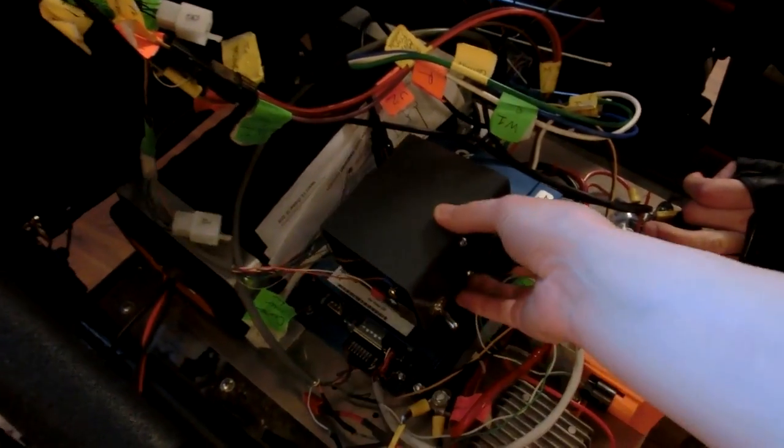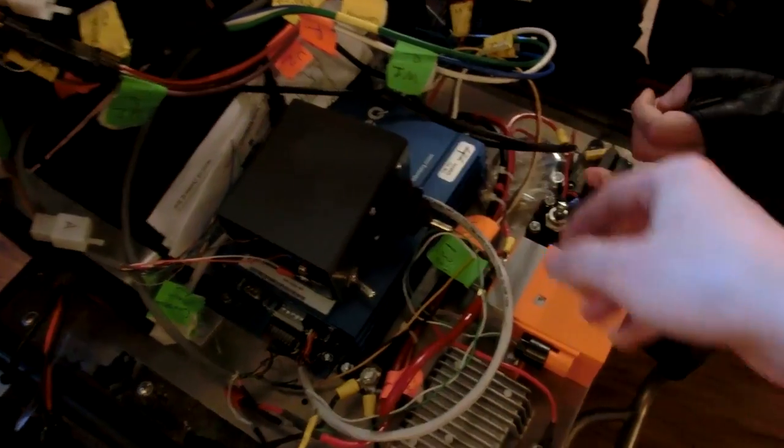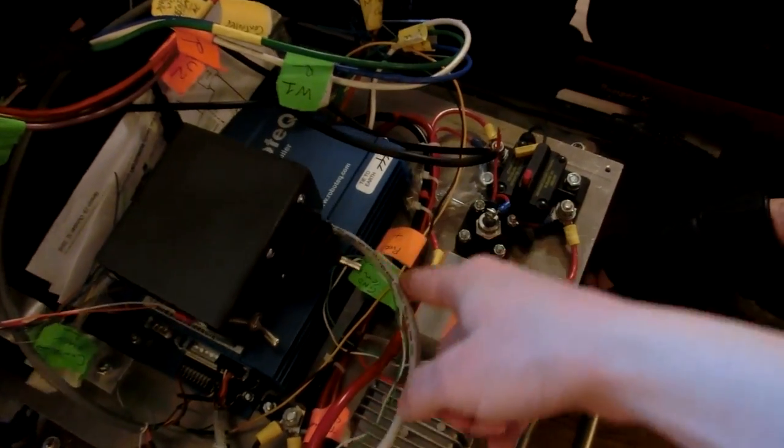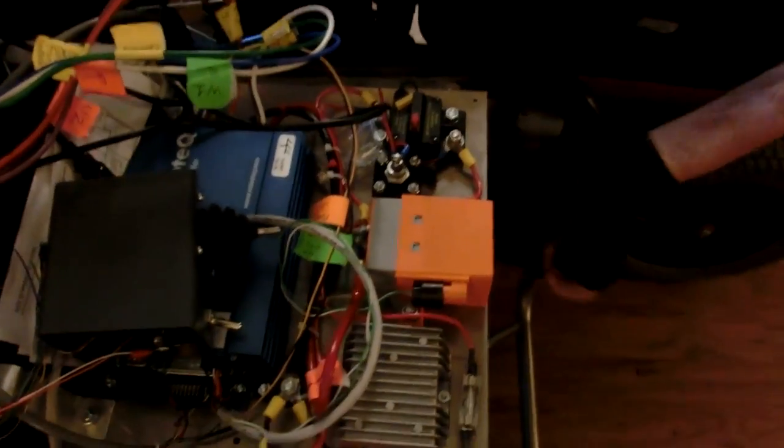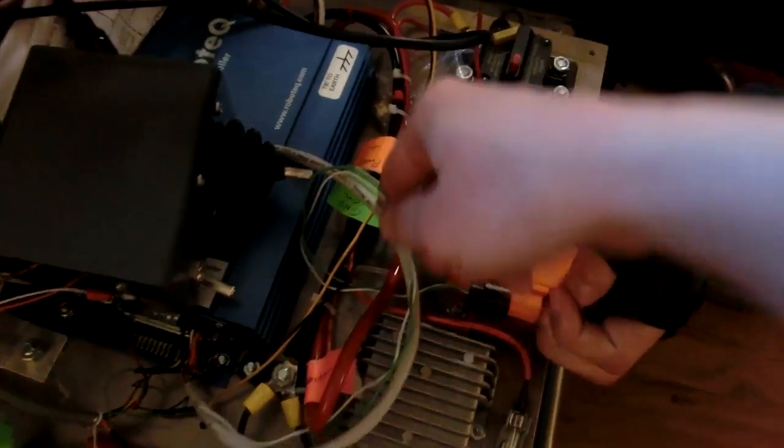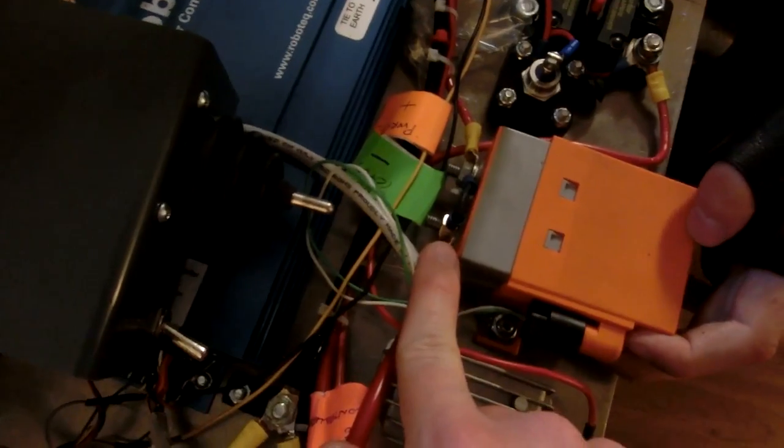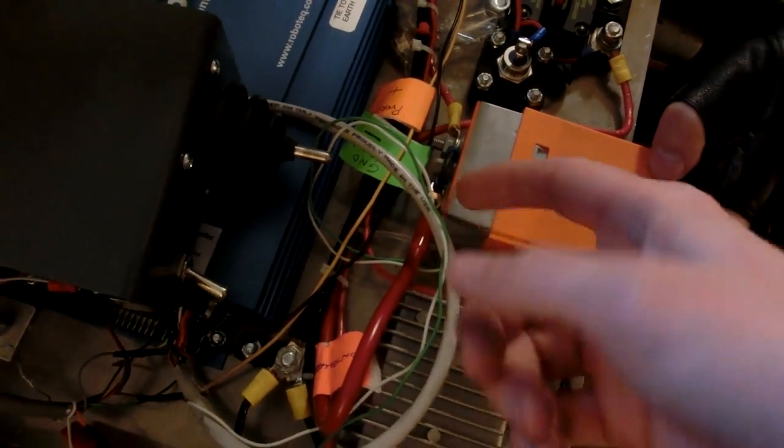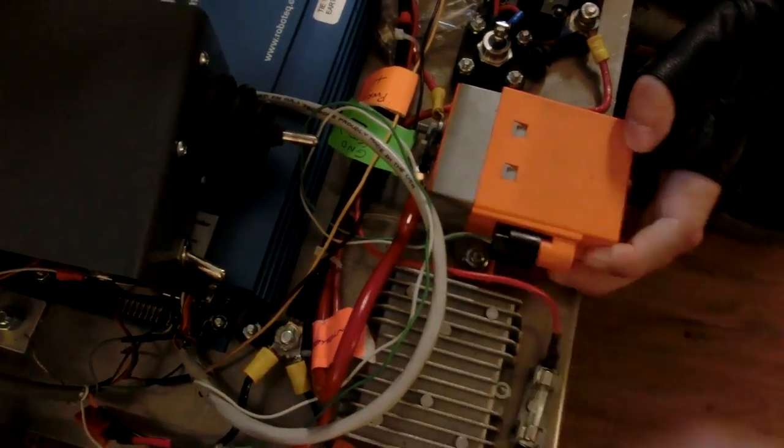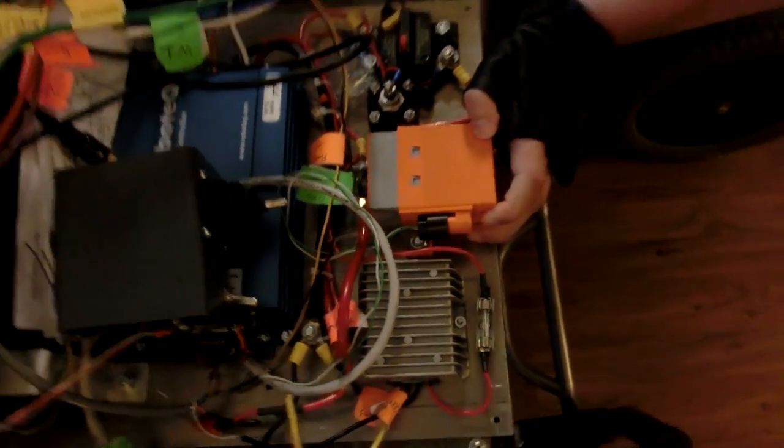You were saying you had an issue with the resistor on the contactor or whatever and you got a new one? Yeah so a little issue with the contactor but got a new one. It was a little overheating because it couldn't handle the continuous current.